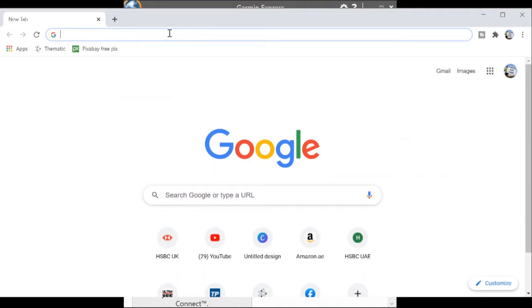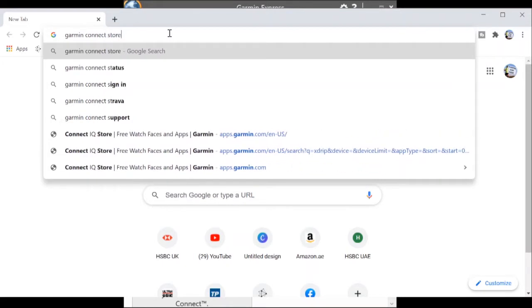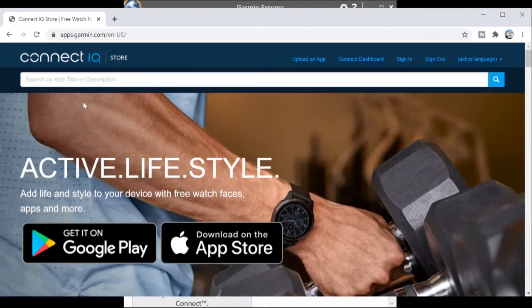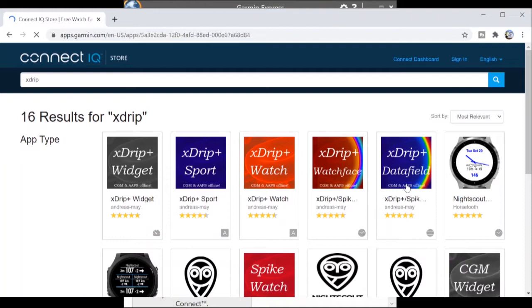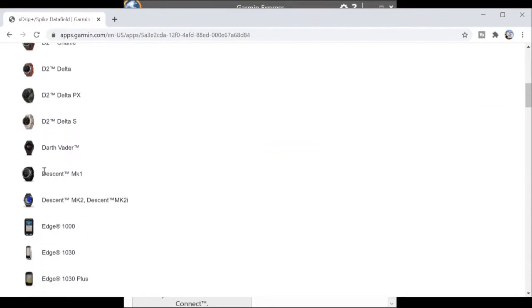To start off with, if you aren't familiar with the Garmin Connect app, simply punch 'Garmin Connect Store' into Google — that will bring up the website you're looking for. You'll see it's app.garmin.com — click on the store. Then use the search option at the top to look for the xDrip app. You want the xDrip data field app, as that's the one that gives you individual data fields inside your running or cycling session.